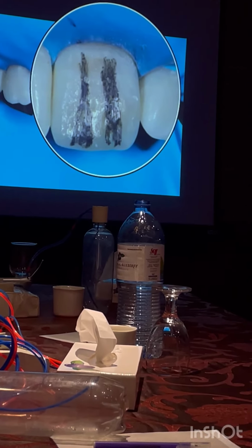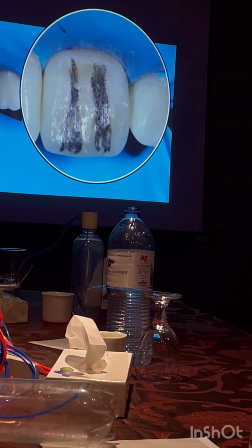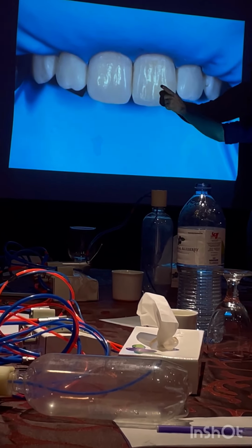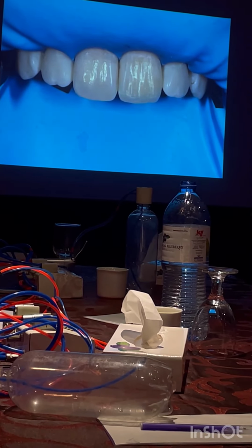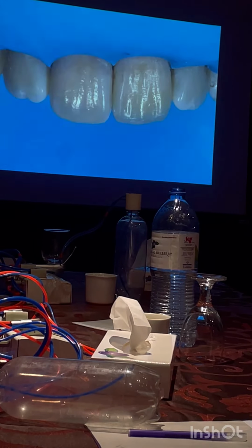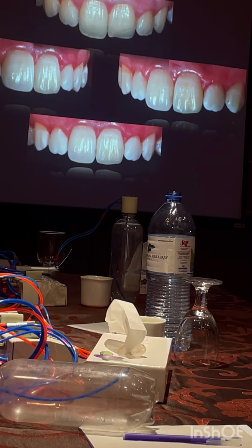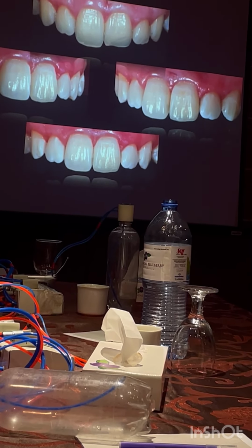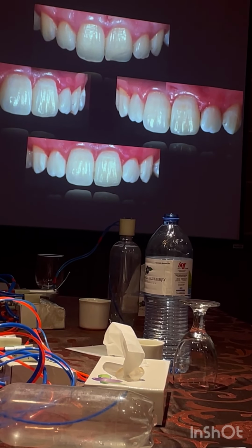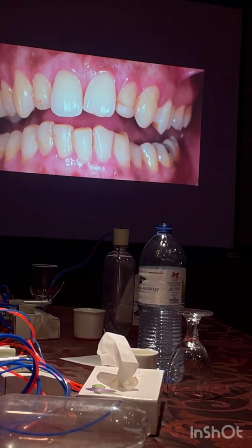And now with your burrs or your abrasives, you remove a little bit of composite in the same area as you have marked. You see? And then you remove it and see, now I got the depressions and the lobes. And then I'll polish. No demarcation line. And there's no demarcation line. I'll polish it and I'm done. You see? Just putting natural anatomy. Very natural. Now this patient says, wow, this looks like a tooth. Okay? Everybody can do it, not a problem.